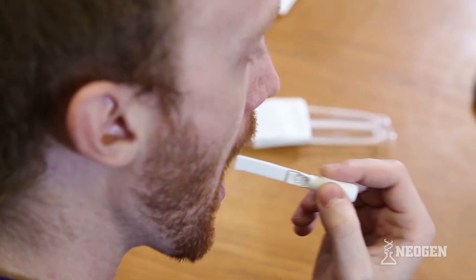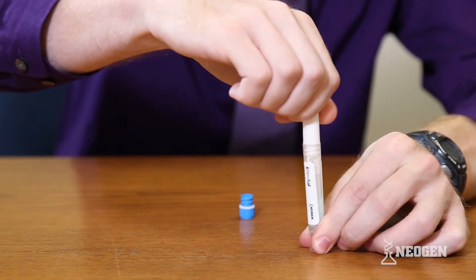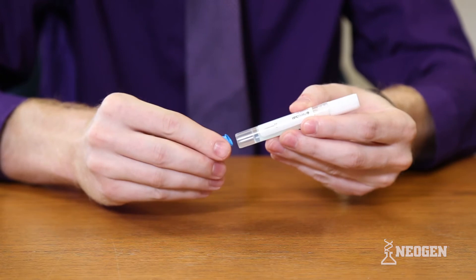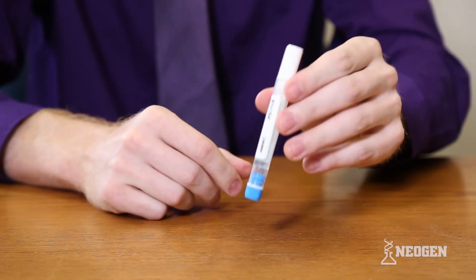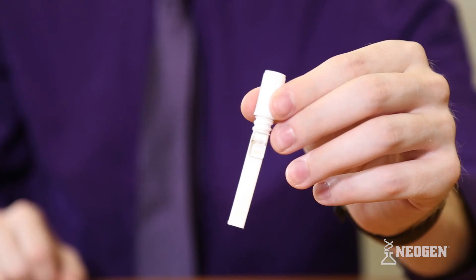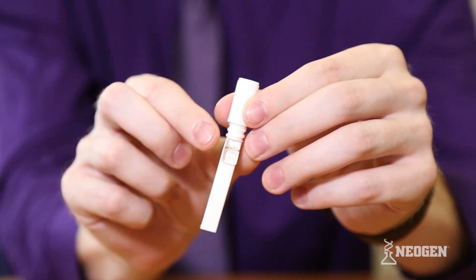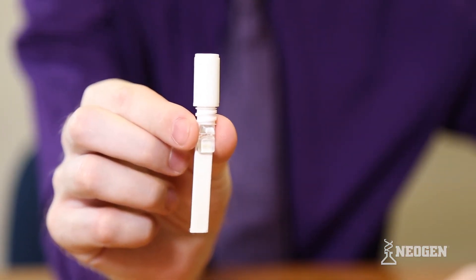The NeoSal collection pad is intended to collect oral fluid by placing the pad between the cheek and the gum. The NeoSal's unique cap-style handle allows the saturated collection pad to be easily inserted into the buffer tube following collection, preventing the need to separate the collection pad from the handle. The NeoSal collection pad contains no oral fluid-inducing stimulants, which eliminates the undesired salty taste produced by other collection devices.